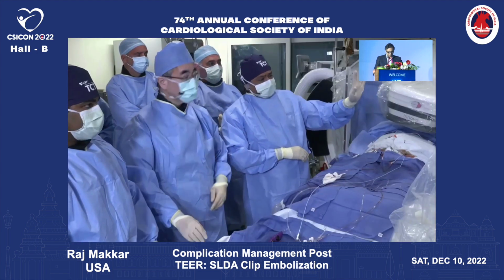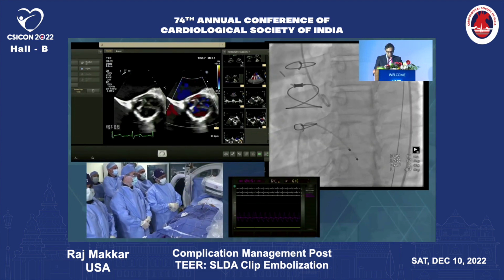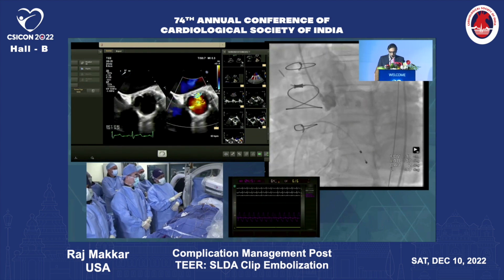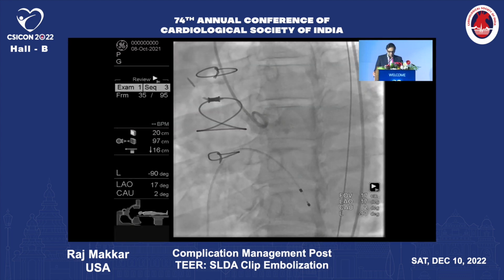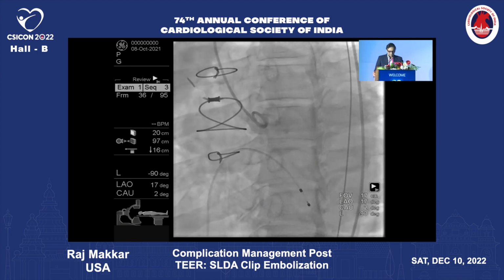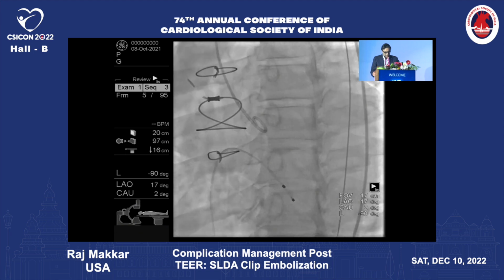Show us what you got. So we'll show you, we took an aortic root injection, all right? So this one was with the pigtail. So this is the coplanar view, and actually if you look at it, you can see the 3 cusps. They seem to be fairly well aligned. Would you agree with that? And then you can, of course, see torrential aortic regurgitation.